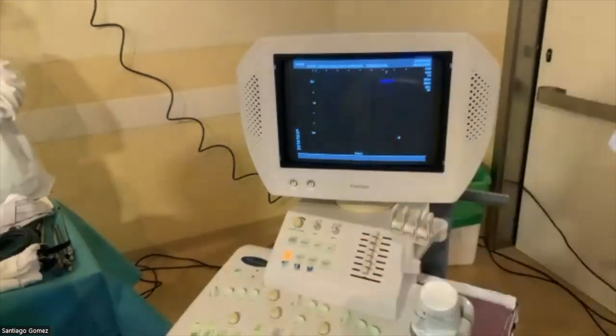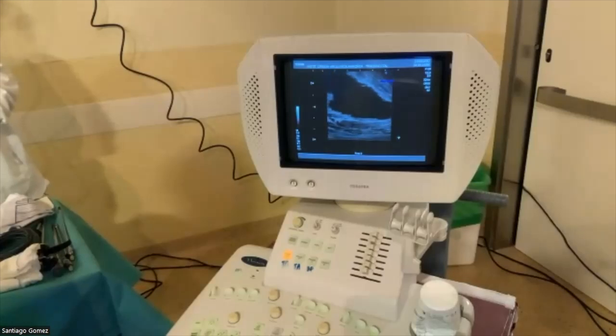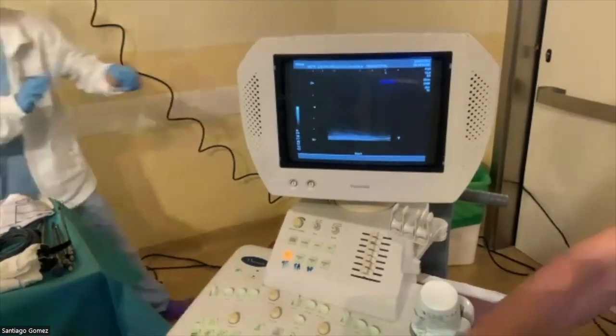This is the longitudinal view. Now, you see, we have done a perfect anatomical clearance of the adenoma. Okay, so we are finished. Let's put a catheter, thank you.